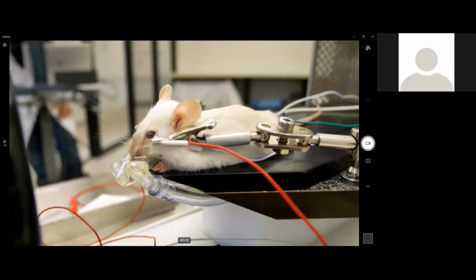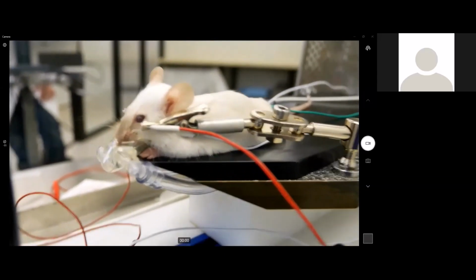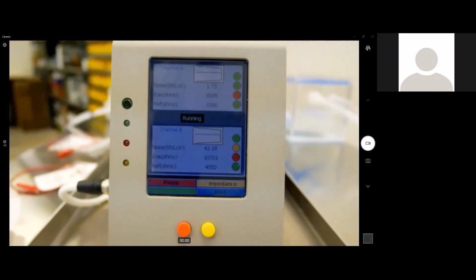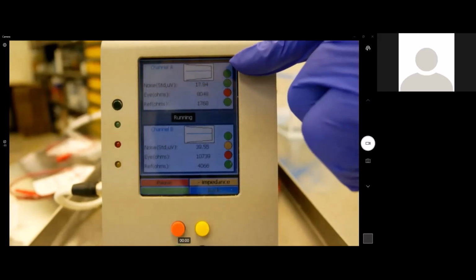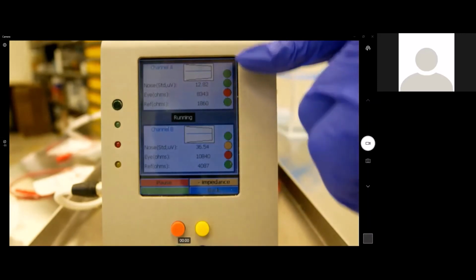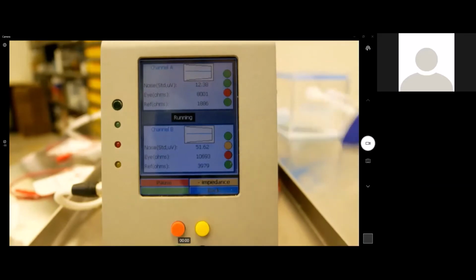Now the mouse has been sitting here. We have it fairly close to stable. Both of the eyes are close to being, let me show you what this looks like. One of the things about the system which is helpful is that as you're conducting the ERGs or setting up, you can look on the screen and see the status of the animal. You can see on the line the animal's very stable, and the noise, even with the cage down, is fairly low. The B channel is picking up a little bit more noise.